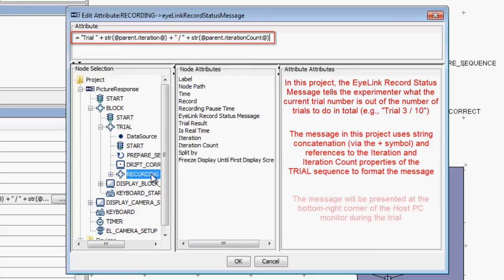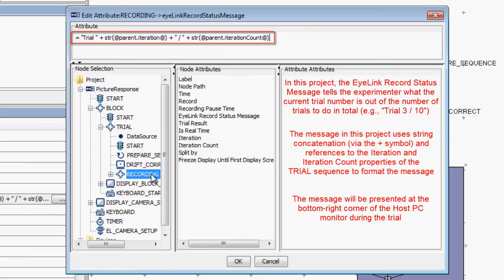The message will be presented at the bottom right corner of the host PC monitor during data recording. This message is not required by the Experiment Builder project, but it's a nice thing to include.